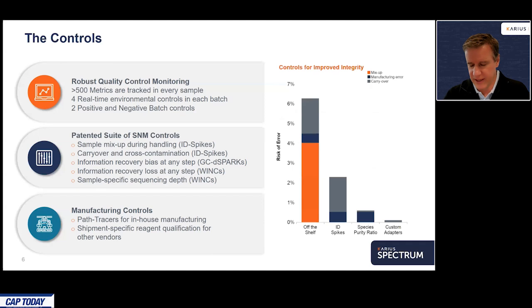The other thing that I just want to double click on is it's one thing to address the errors in the accuracy per specimen, but this is a really powerful and highly sensitive approach that faces some of the same challenges as other very sensitive approaches like quantitative PCR. So when we started the operationalization of this, we really learned as much as we could from those other high throughput labs doing very sensitive testing at scale, and developed a number of quality control strategies that we believe address the unique challenges of metagenomics. We can go through these in more detail. They've also been published in Nature Microbiology back in 2019 and several publications since.